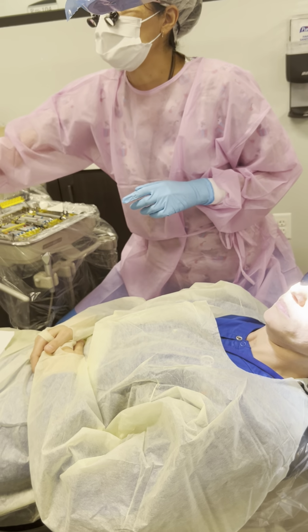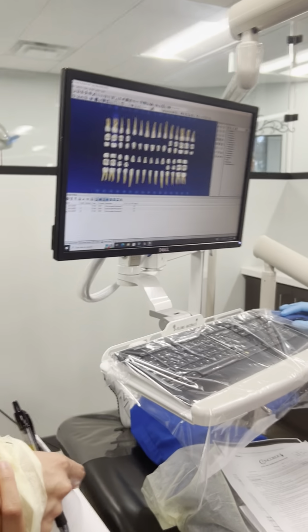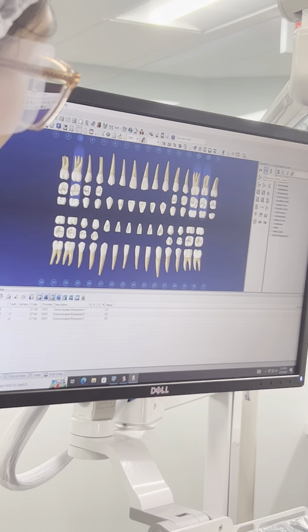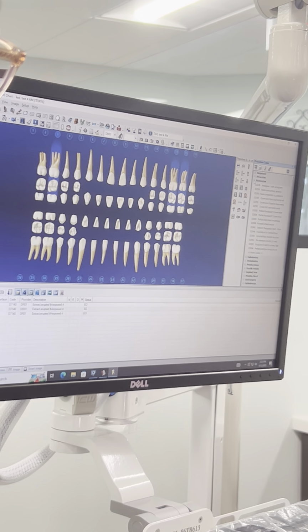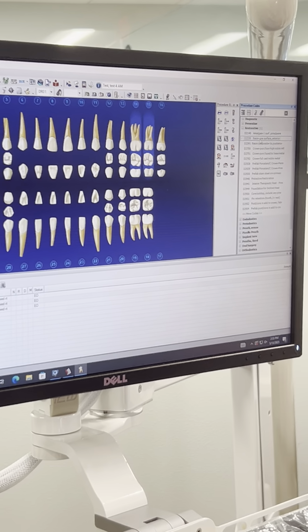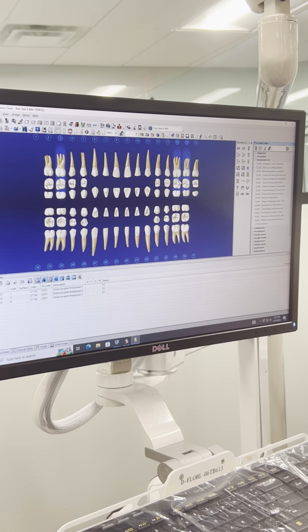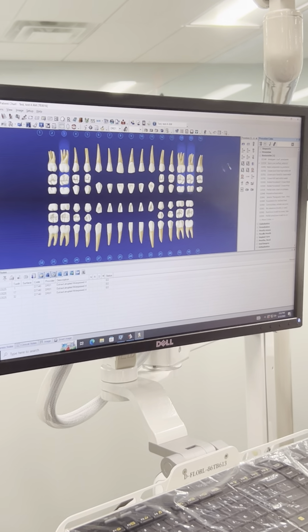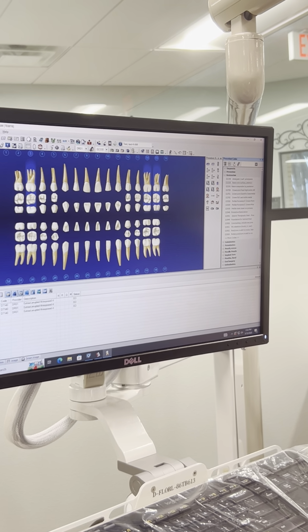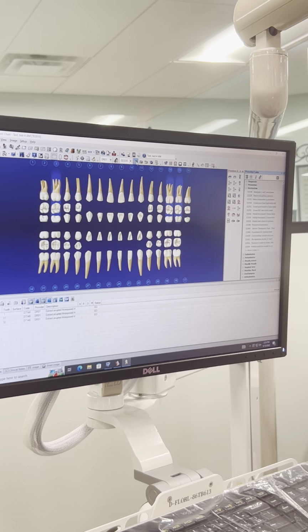So I can click on 3, 14, 15. I can click here for resin composites or restorative. I have amalgam, resin. Even if it's one surface, that's okay, because once we select the teeth and the surfaces, they're gonna change the code for posterior. If I'm selecting something from the list, I'm gonna click on the check mark, and then EO.